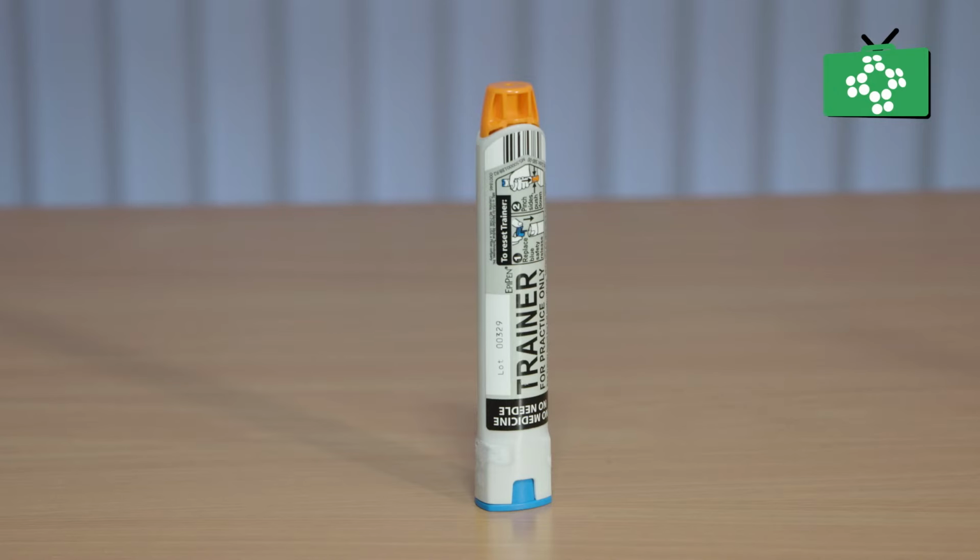The EpiPen is an auto-injector that administers adrenaline, and it's carried by people who have anaphylaxis in case they go into anaphylactic shock. There are two types of EpiPen, the EpiPen and the EpiPen Junior. To avoid accidents and prevent damaging the EpiPen, they should always be carried in their case when not in use.